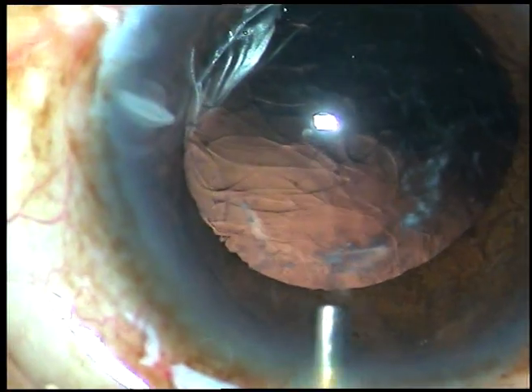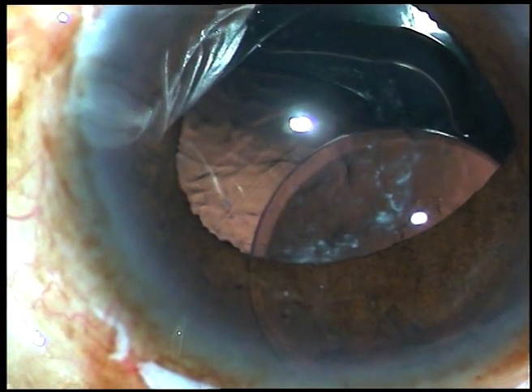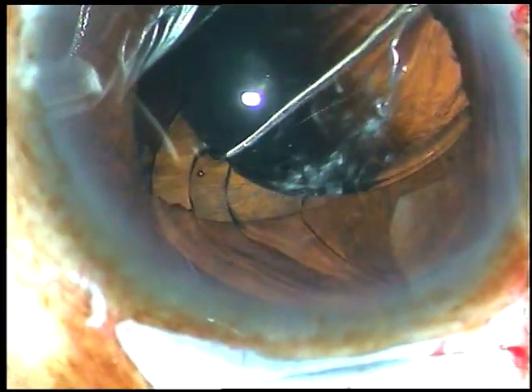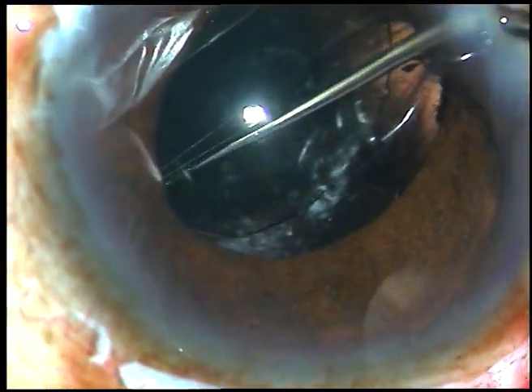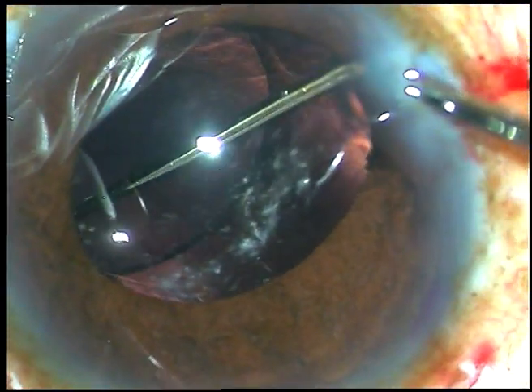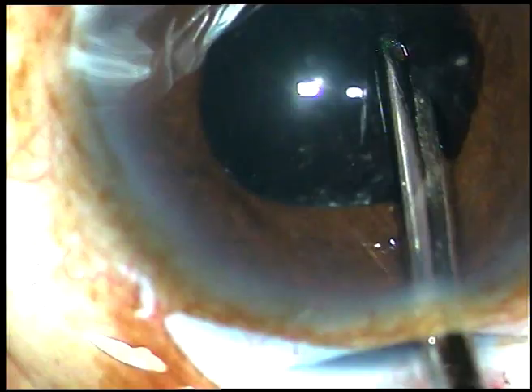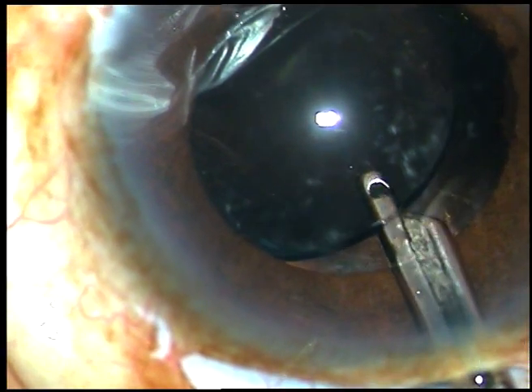Then viscoelastic substance is injected and an intraocular lens is implanted. If you are implanting a foldable lens, place it up to this point. Go through the side port with a Sinski hook, pull it and place the trailing haptic first in the capsular bag. Now dial the lens and place the other haptic in the capsular bag. The reference is the rhexis margin at 12 o'clock. Because the pupil has become small, the rhexis margin is not visible in other parts. In this case we can see some white material sticking to the posterior capsule — it could not be polished out. If necessary we can do YAG laser capsulotomy later on.